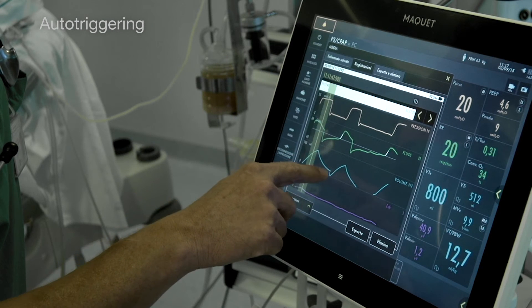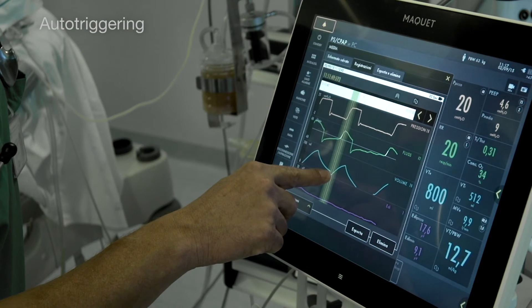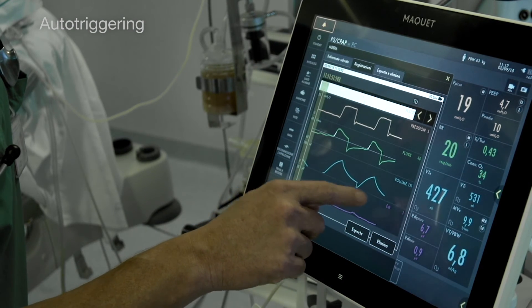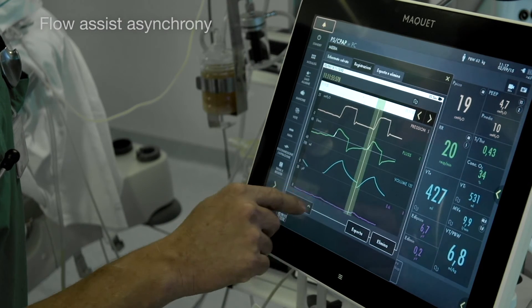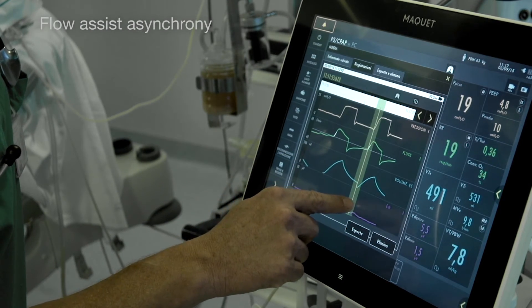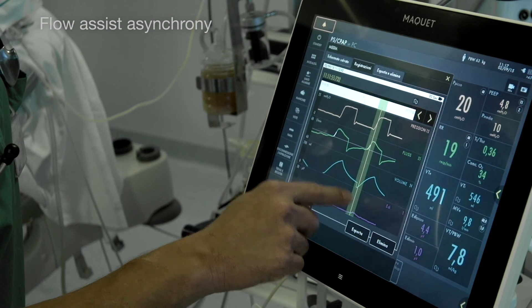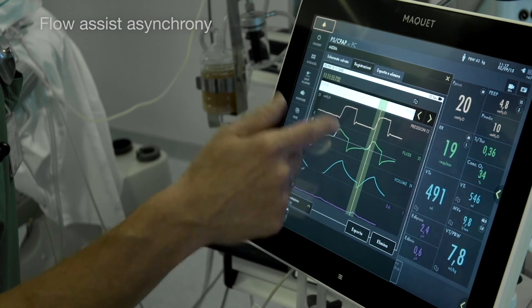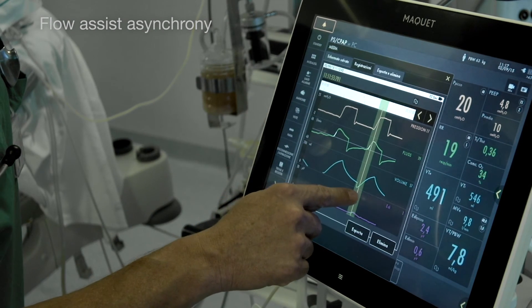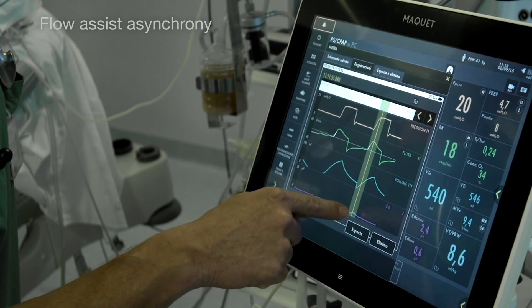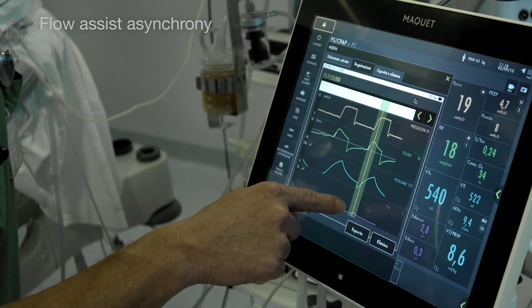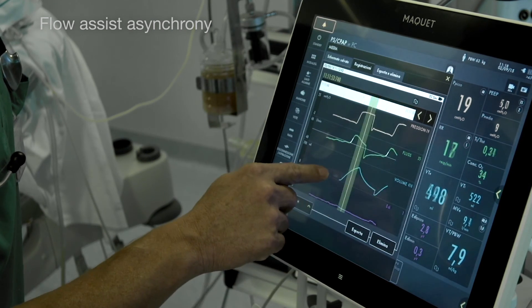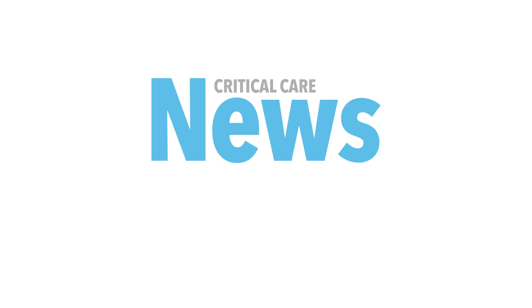Auto-triggering again. And here is a flow asynchrony example: a small effort from the diaphragm triggers the ventilator, with not a huge delay in opening the valve but only a small diaphragm contribution.